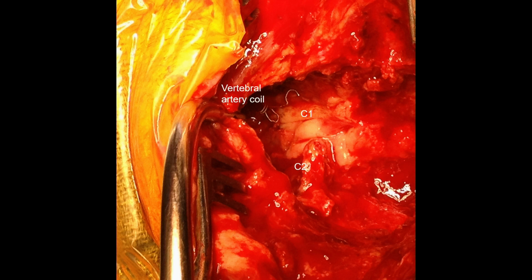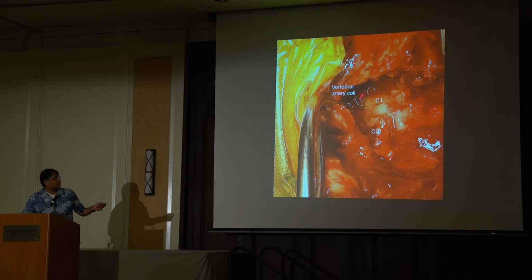So then I have to reoperate. So when I reoperated, this is what I see. I see the coils coming out of the vessel hole.